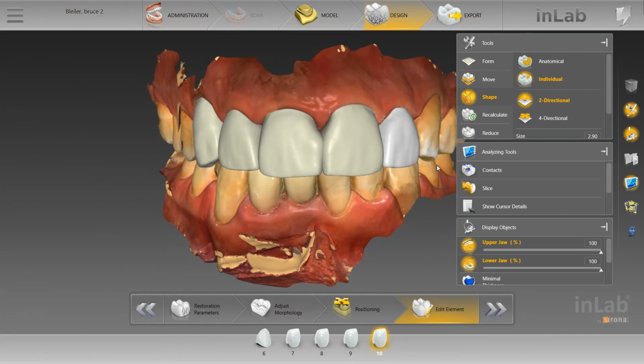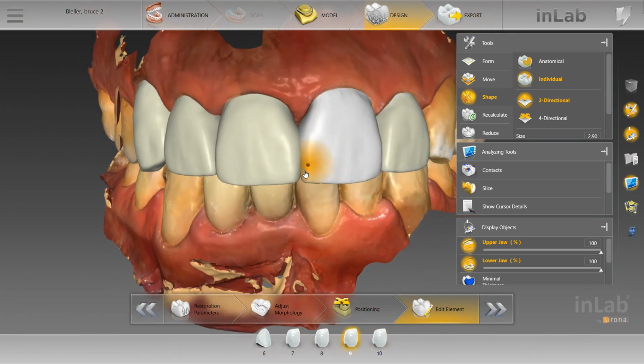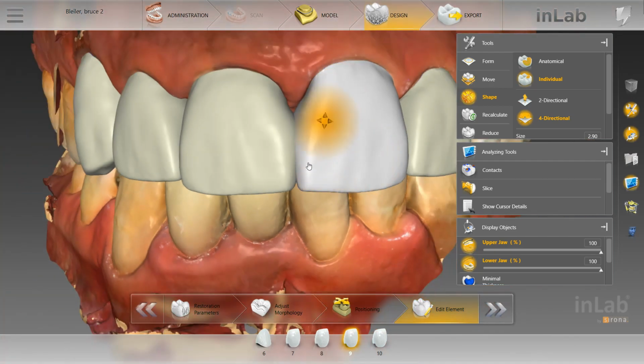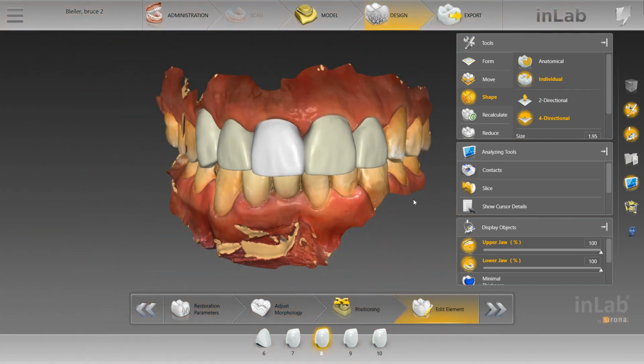First thing that I do, and it's usually not this off, we'll just make it more realistic. First thing you're going to do is get the contour lines right. So what I do is I'll grab the 4-directional and I'll grab these contour lines, just get right above them and then move it where you want it. So this one, it's good enough. And then we're going to move this one, and this is actually good right here. We're going to go a little higher, and then we can bring that in, bridge them together. So say there's our contour lines. We've got that established.